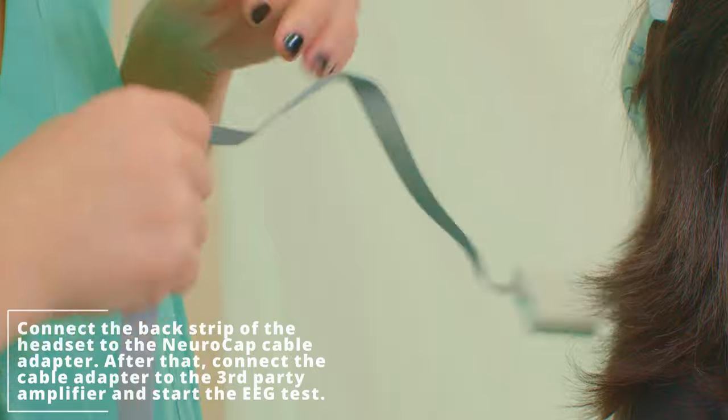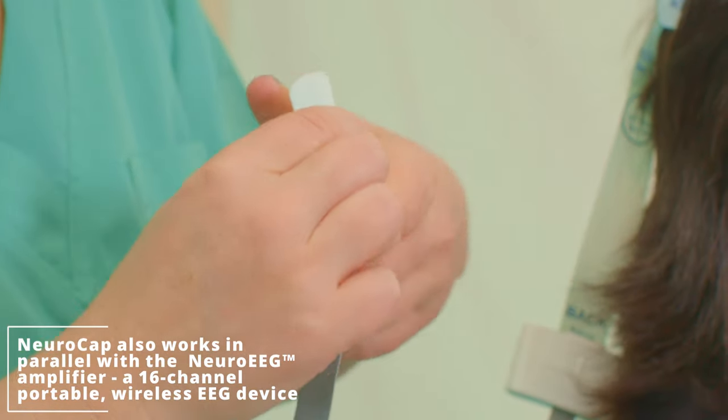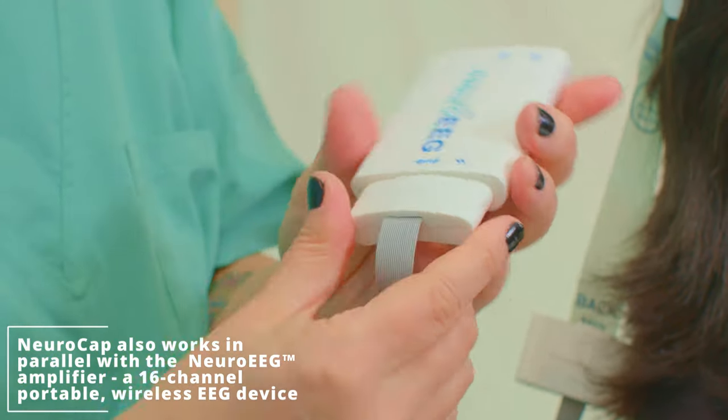NeroCap also works in parallel with the Nero EEG amplifier, a 16-channel portable wireless EEG device that fits in the palm of your hand.